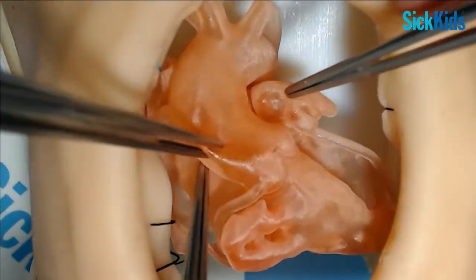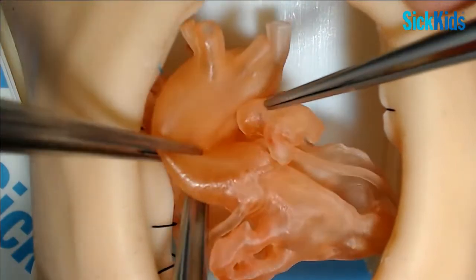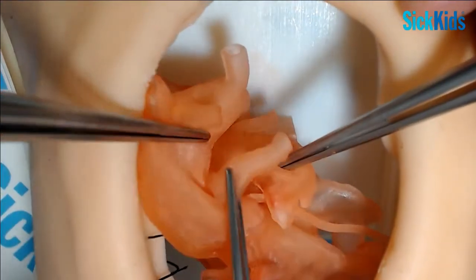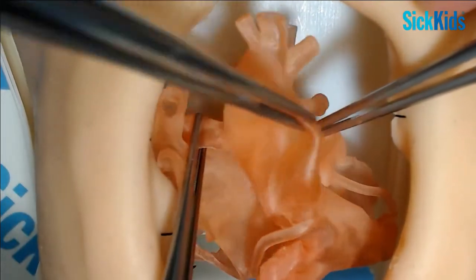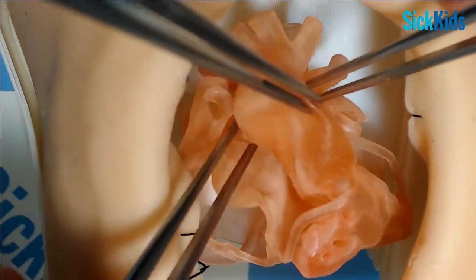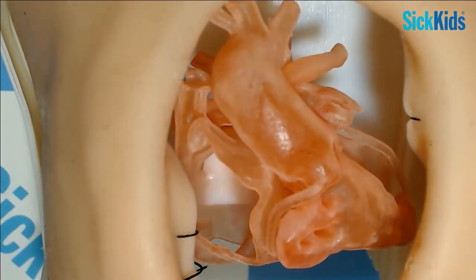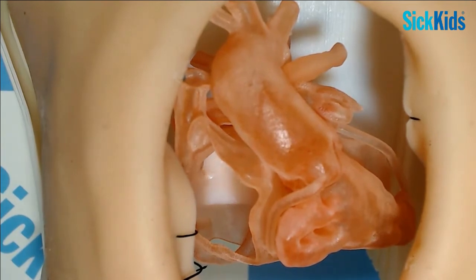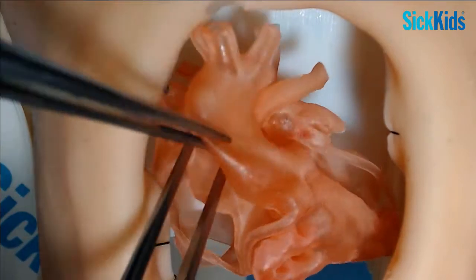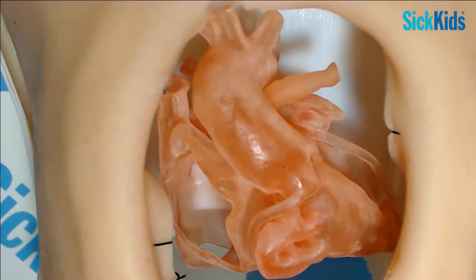So you're looking for your pulmonary arteries to see how the pulmonary arteries relate to the trunk itself. So freeing them up, and I guess these arise pretty well straight at the back from the main trunk, and probably slightly more commonly they can arise a little bit more to the leftward side, but these arise pretty well at the back, and it looks like the origins are almost touching each other.